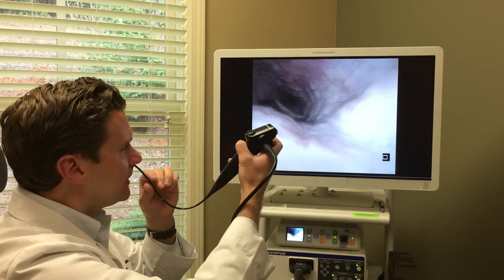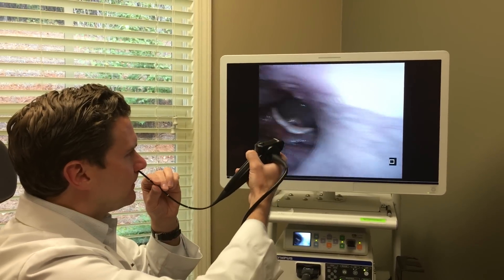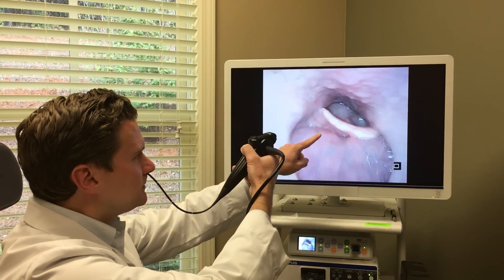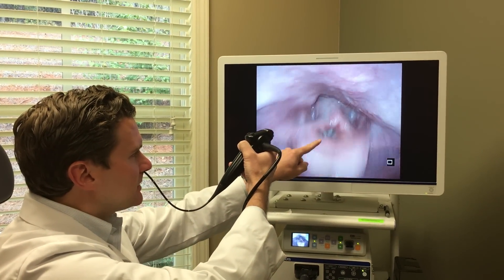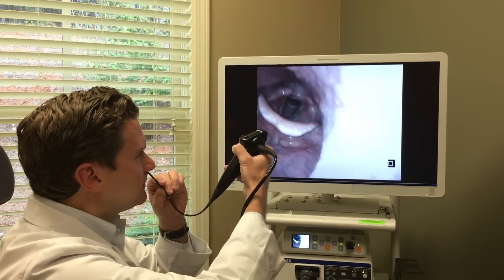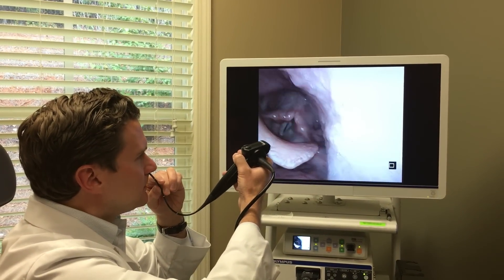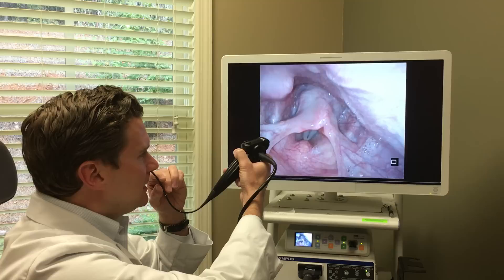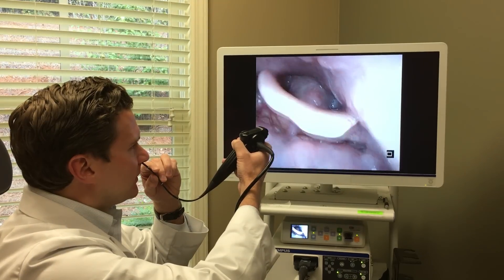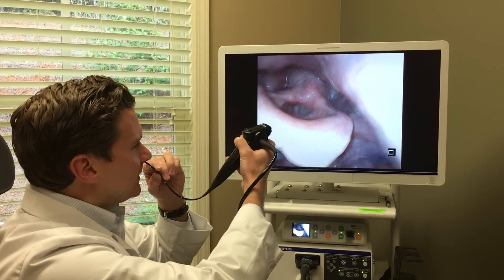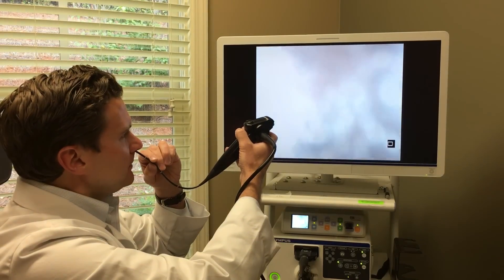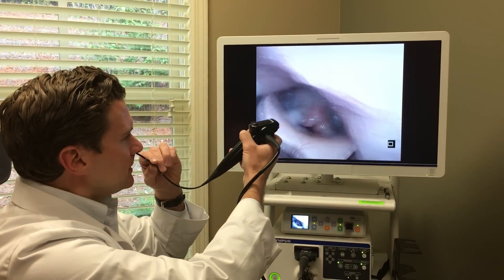And we're going down. You can see my epiglottis here. There are my vocal cords. The vocal cords obviously come together when we speak. When we take a big breath in they open nice and wide.